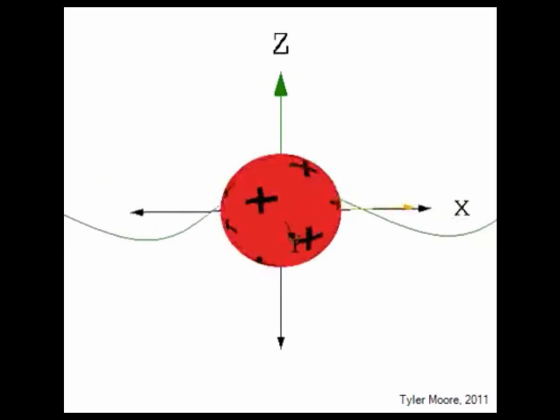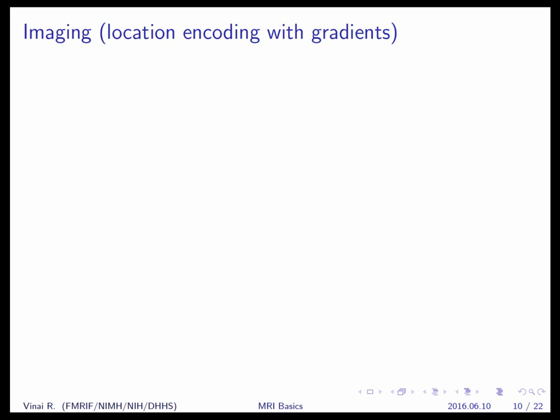Okay, so here you have a magnet that's giving you a signal pool, and you're essentially using the concept of resonance to be able to extract a signal from that pool. Now, if you put your subject in the magnet and you apply an RF field that's resonant with what's happening in the magnet, what do you think you get back?